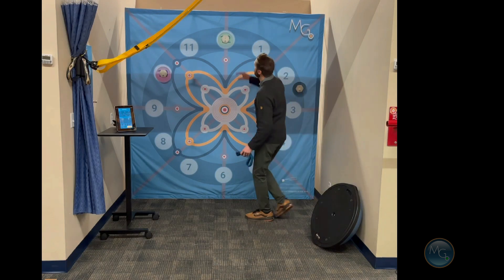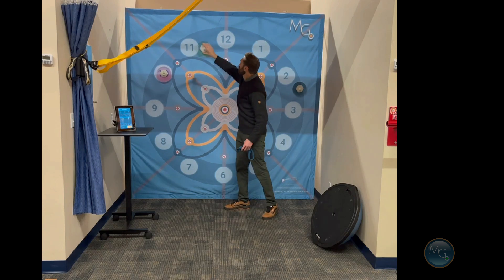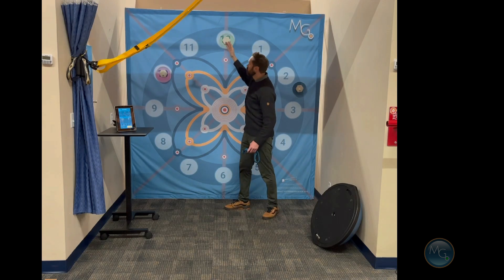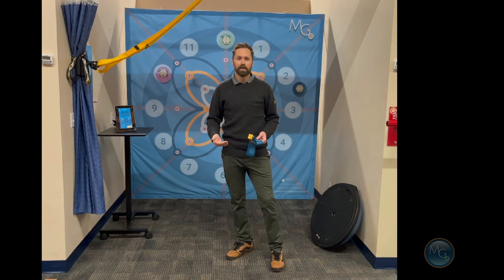One really cool thing about this is the pods can magnetically attach to the tracking grid. So you can slide them around where you see fit and use up to 10 pods with the interactive app using this system.